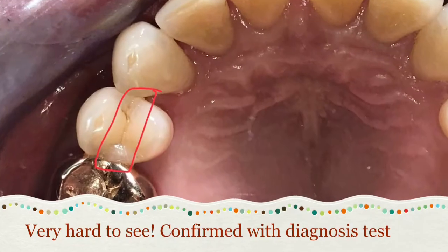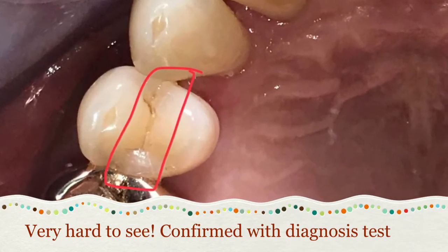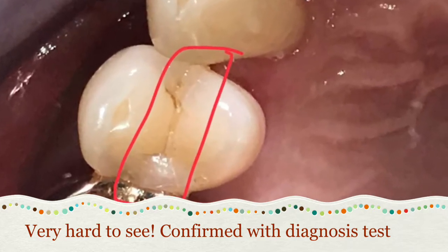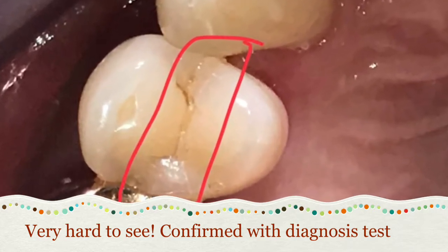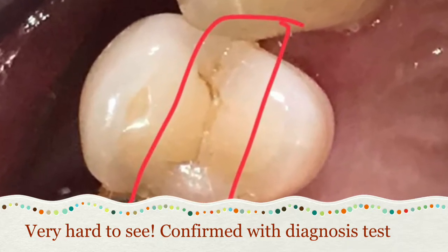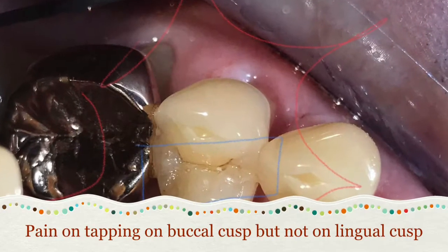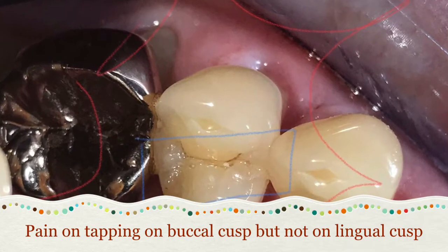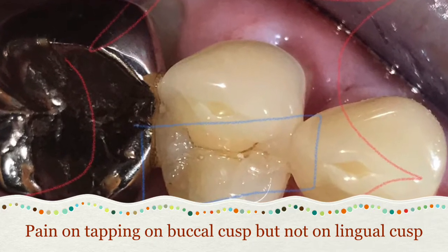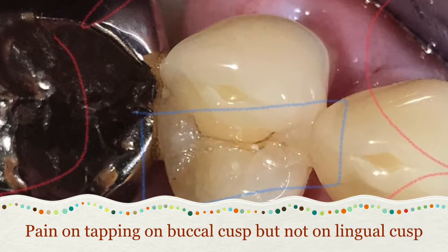When I initially take an X-ray and look at tooth number 12, the X-ray doesn't reveal any signs of infection or a necrotic tooth. There's no cavity, and I can't see anything that would indicate a root fracture or tooth fracture.